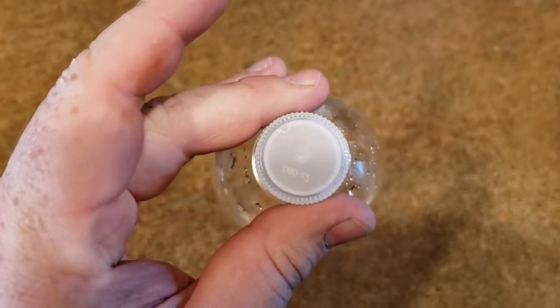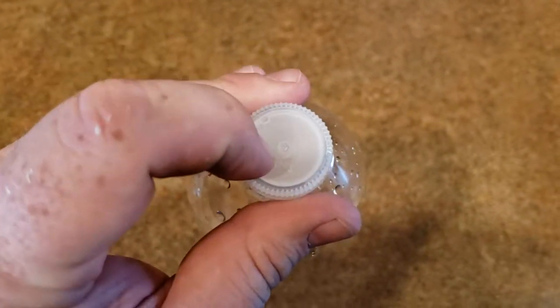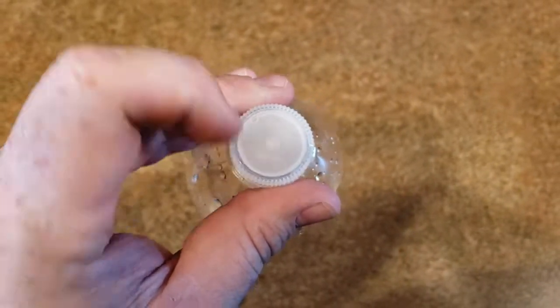It's kind of got a mark there for the center where the equipment closes that cap off when it extrudes the plastic. Go ahead and drill that out there to fit the oxygen tubing from your concentrator or oxygen tank.